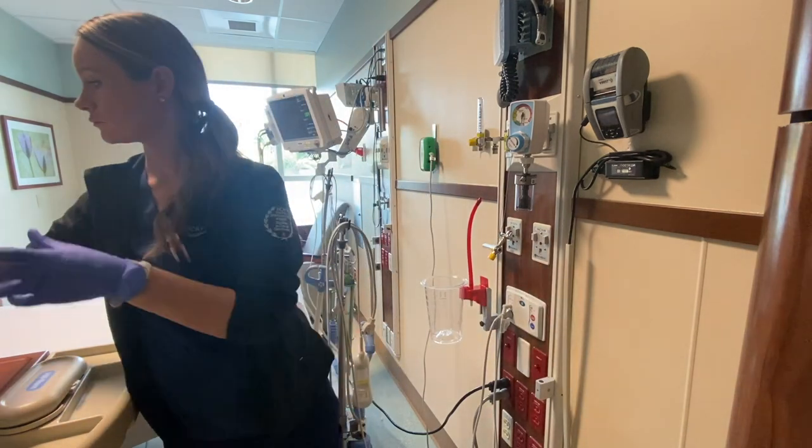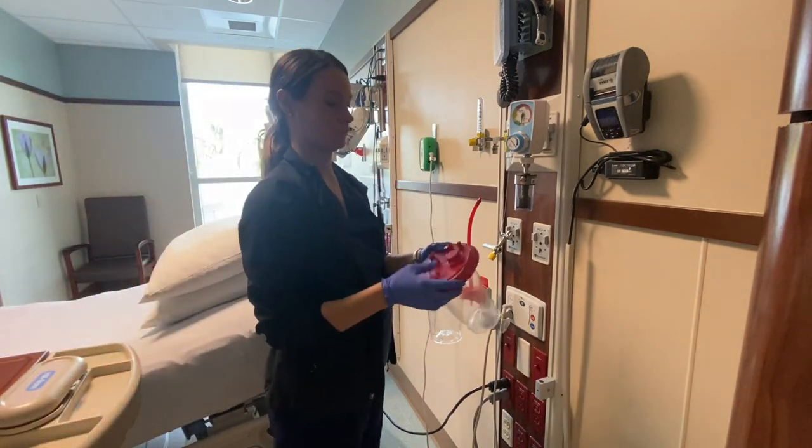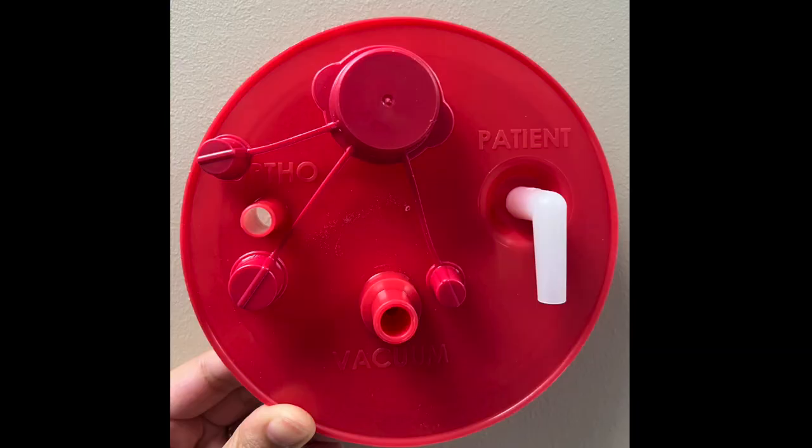Then I'm going to take the inner canister and connect the top and the bottom together. On the lid, there are a few openings. As you see here, one that says ortho, one that says vacuum, and one that says patient — it is a little hard to read. What we're going to do is we're going to cover the ortho and we're going to leave the vacuum and the patient open.